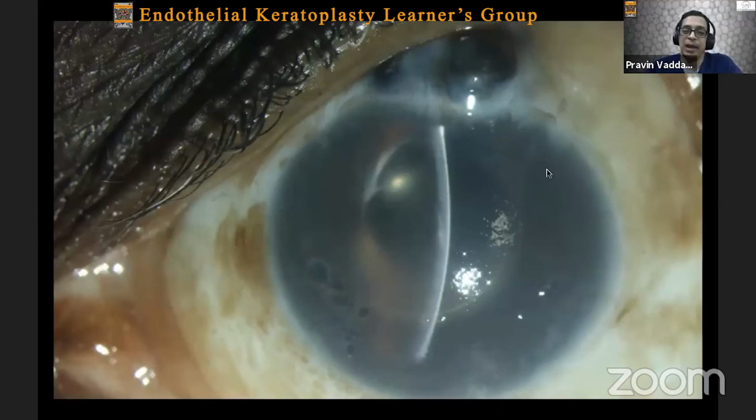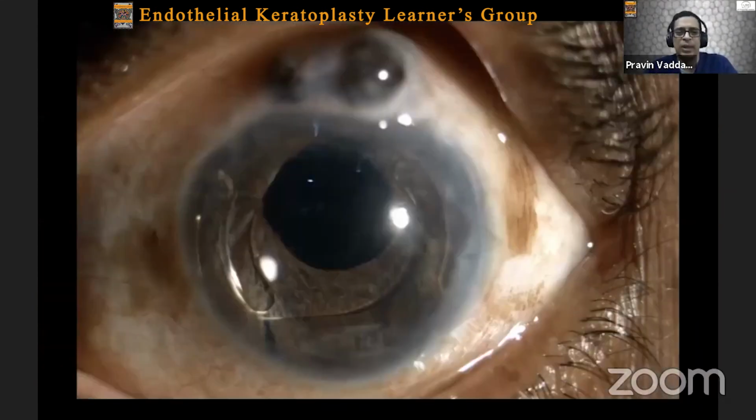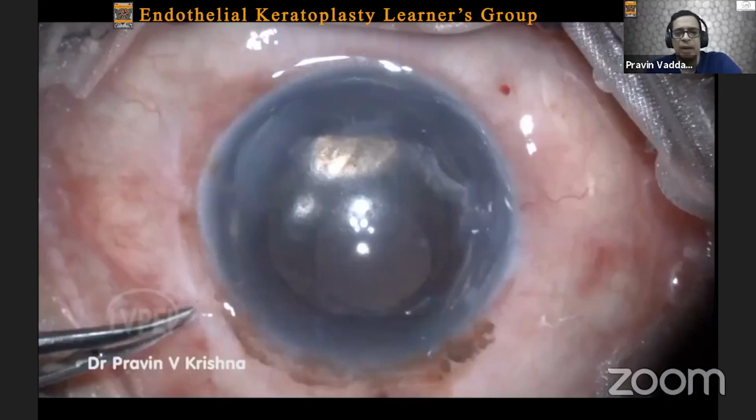You might also have surprises like this. This is a patient who underwent a filtering surgery, apparently an iridencleisis that went wrong several years ago, and he had an ACIOL. The patient was operated on more than 30 years ago, and eventually he developed bullous keratopathy. He was a one-eyed patient. Because he had this IOL in the eye for such a long time, we decided not to touch the IOL and instead just did a DMEK. That is enough in a patient who's had a lens in the eye for such a long period, where the amount of corneal edema from a stable lens probably changes only over a very long period of time. So I would leave a lens in place like that.